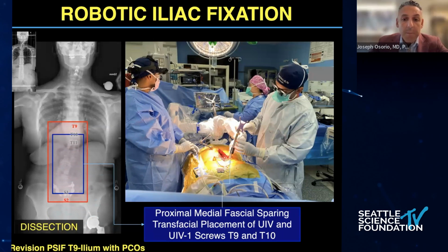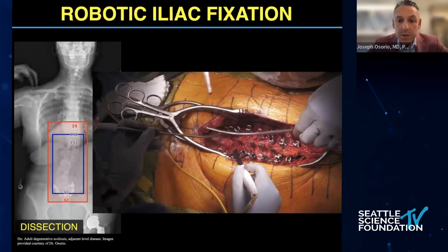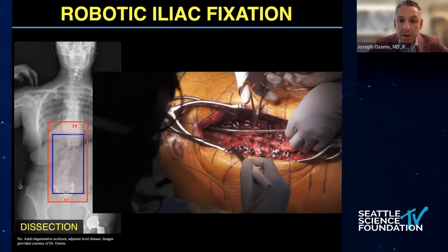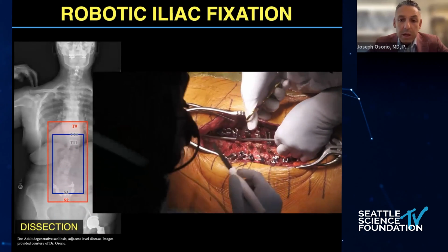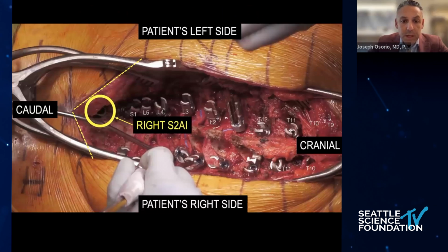And so at the top, in a case like this, and you'll see it in the video, I've spared the proximal tissue, and I'm simply showing the rod so you can see the length of the construct and how it relates to the size of the incision. But if I zoom in closer into the image here, you can see I don't have to dissect that entire region where in this case I used an S2AI screw. I can spare that distal dissection.